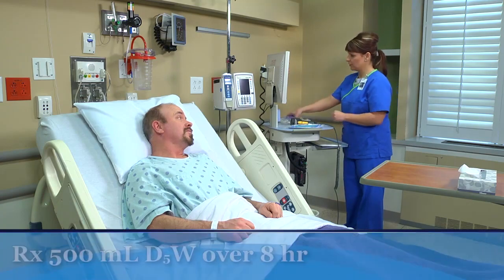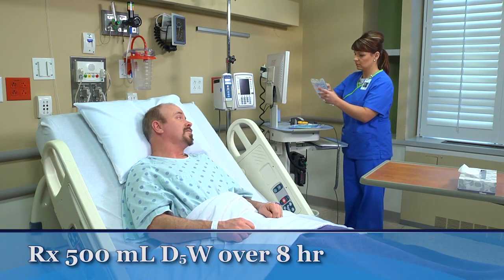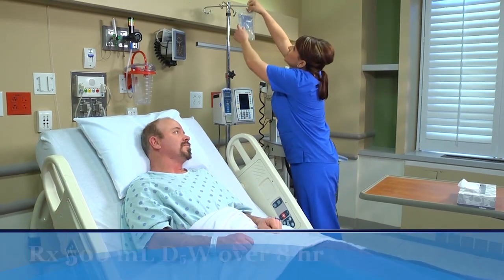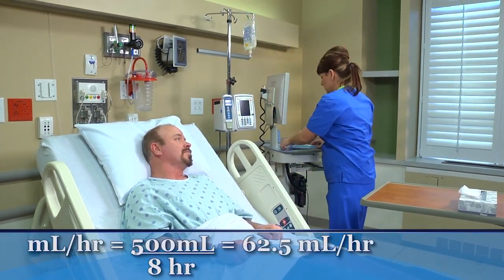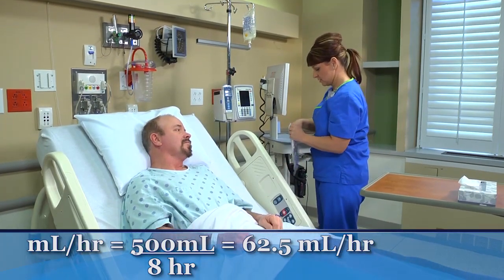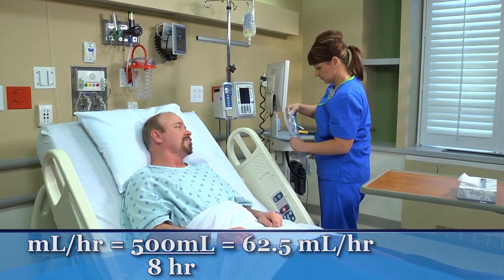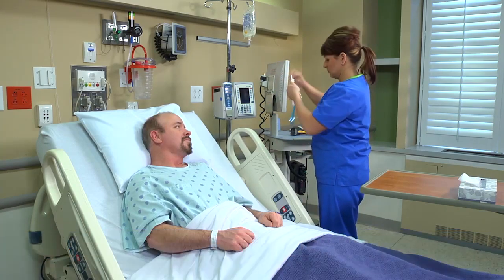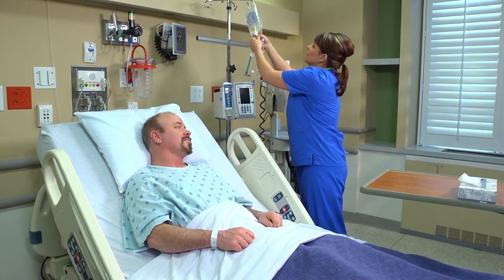Suppose the healthcare provider orders 500 milliliters of 5% dextrose in water to be infused over 8 hours. To calculate the flow rate in milliliters per hour, divide the volume by duration, that is 500 by 8, to yield 62.5 milliliters per hour. You'll set the pump to infuse at that rate.